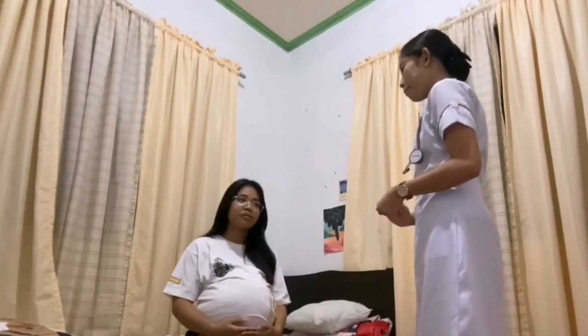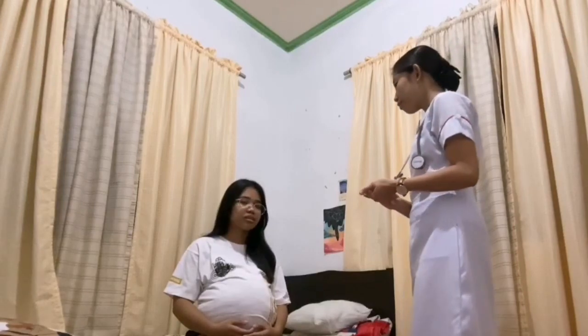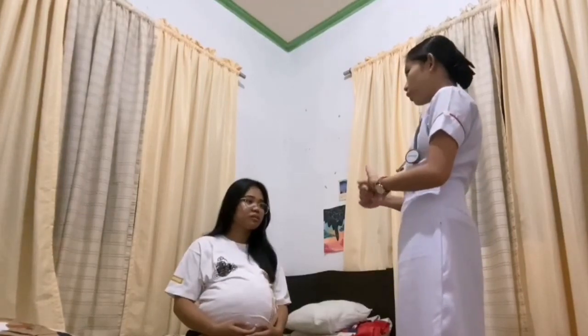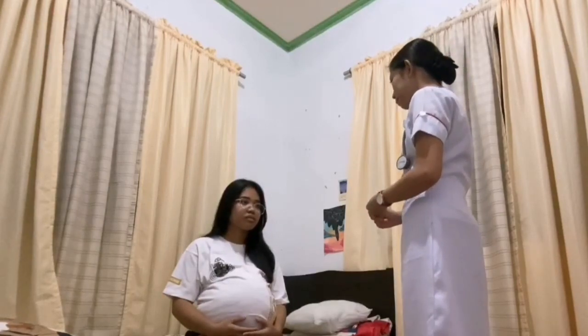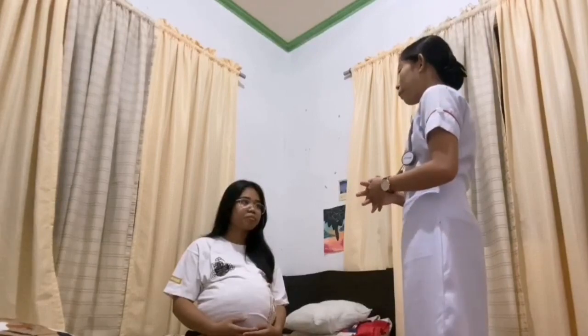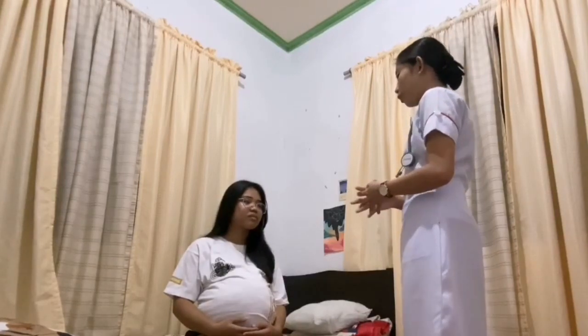After that is to explain the procedure to the patient in order to gain cooperation. Good day, ma'am. I am Laika Giselle P. Comilla, your student nurse for today, and the procedure that we are going to do is the Leopold's Maneuver procedure. In this procedure, I will be needing to palpate your abdomen. Would it be alright with you, ma'am?